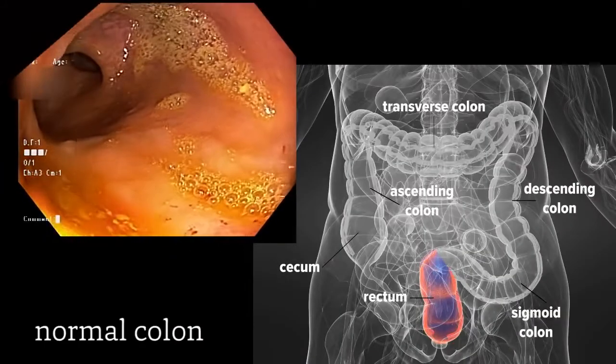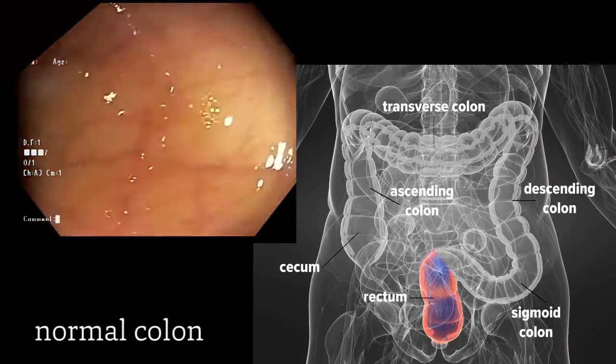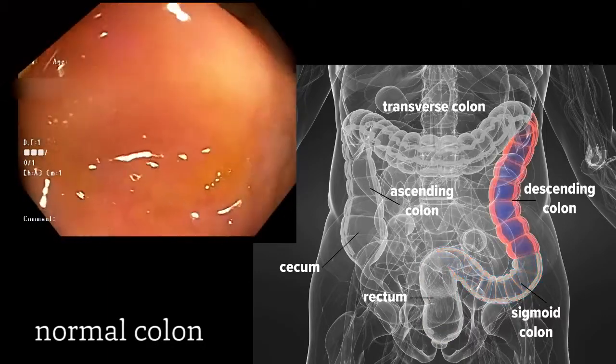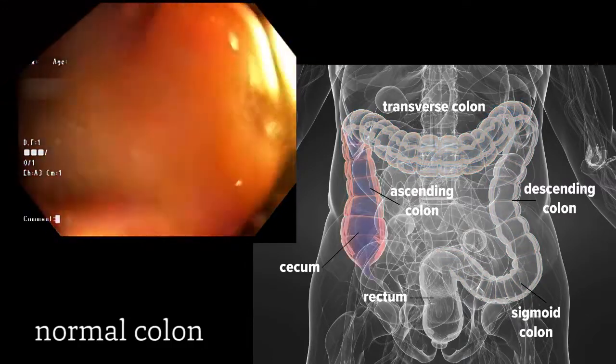We're entering through the rectum. And as we move beyond the rectum into the sigmoid colon, our goal is to gradually reach the end of the colon, which is the ascending colon, and specifically the cecum.